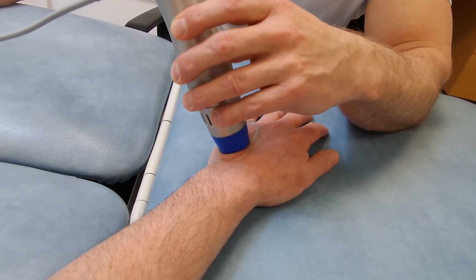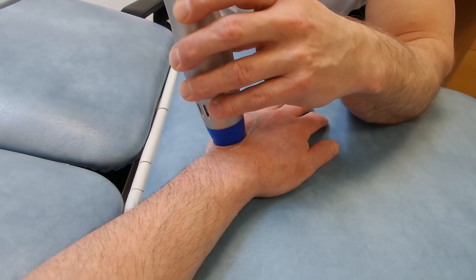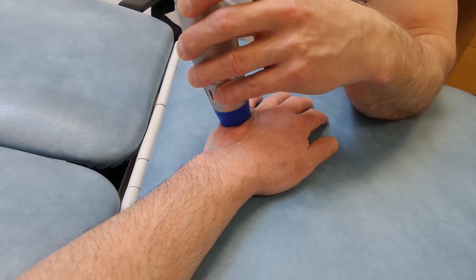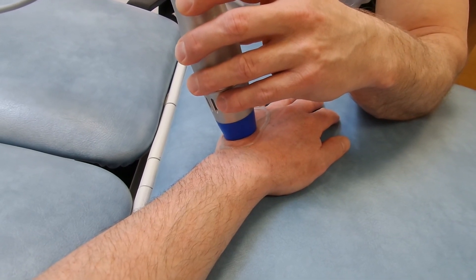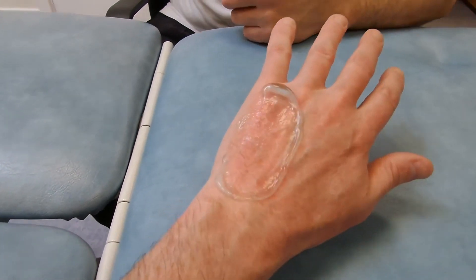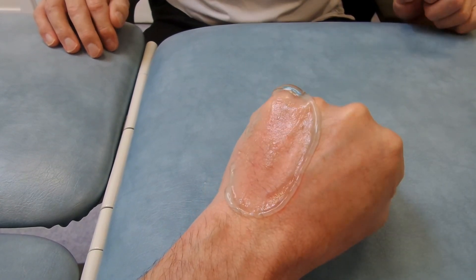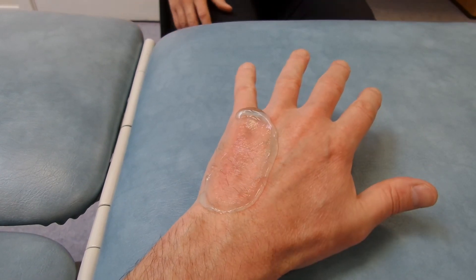I can really feel it penetrating right in. I like the fact you can hear the change in tone — when the change in tone comes on you know you're on the right spot, you know you've got the right angle. That is 2000 shots. The shock off the electromagnetics is very, very direct. And that change in tone — I do like that. That was intense.